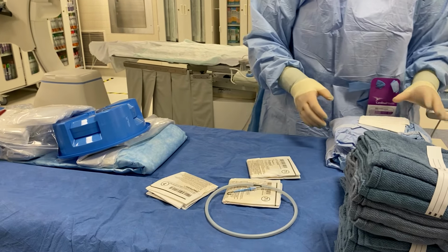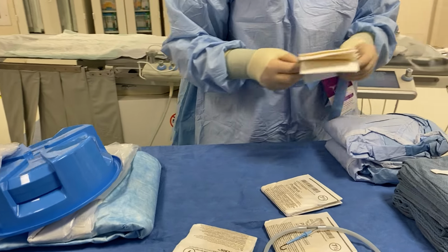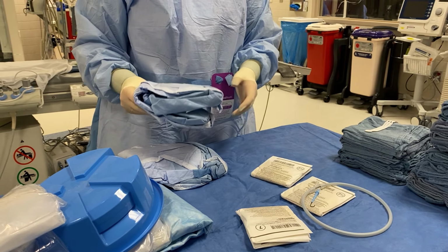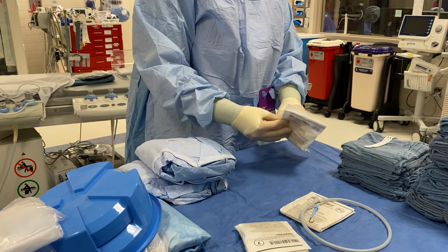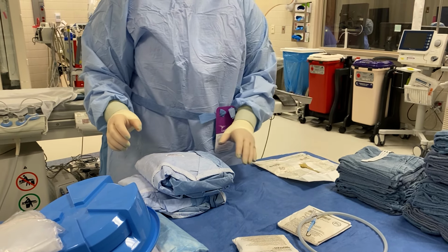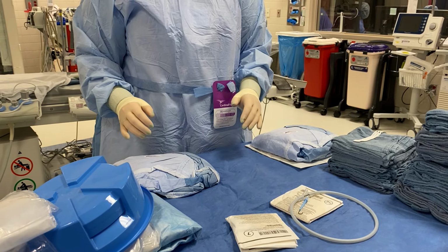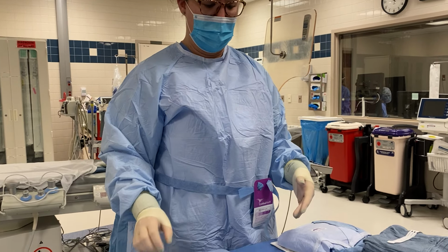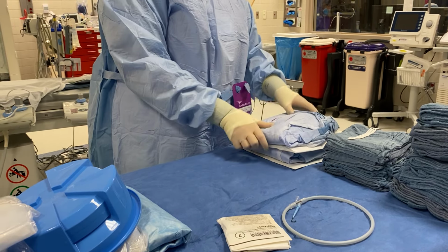The first thing I'm going to start with is getting the gown and gloves for the procedure ready. So we start with the physician's gown and gloves first, and that's going to go on the bottom. This doctor wears a size 7.5, so we'll lay his gloves out and then his gown on top of that. And then we'll lay the scrub tech's gown and gloves on top of that. So we'll lay down another pair of gloves and then her gown.